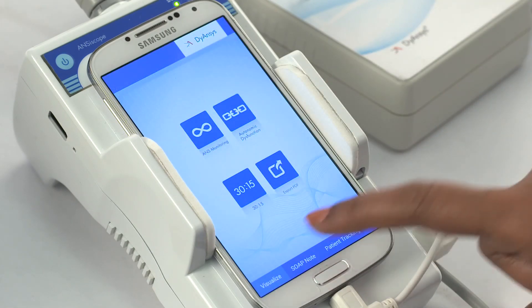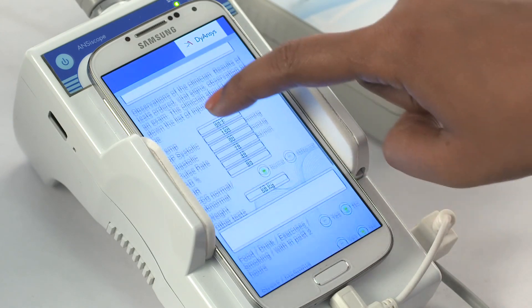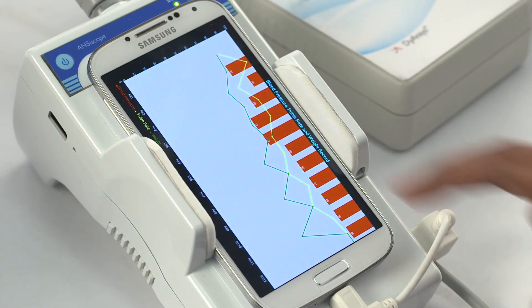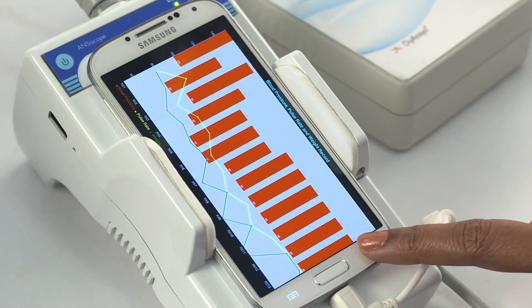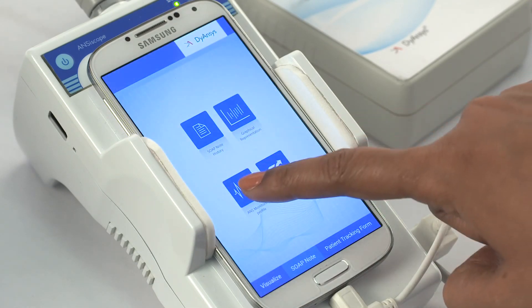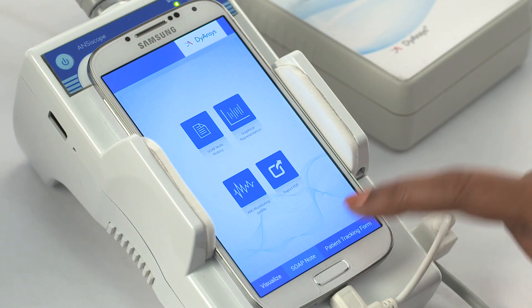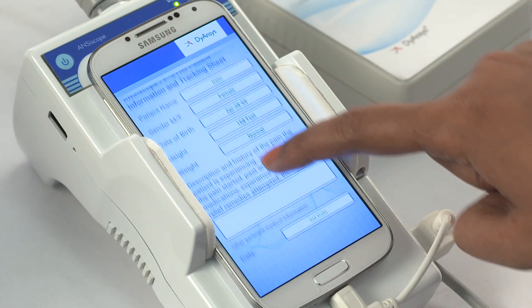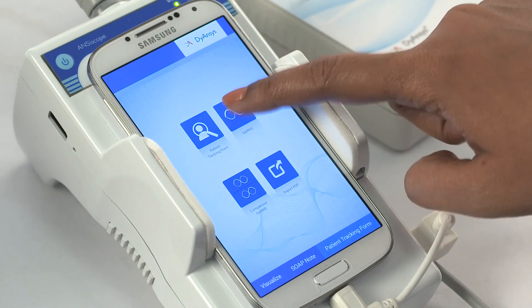Select the SOAP note. Press the SOAP note history to find all patient SOAP records. Then go back. Select the graphical representation to view the graph of all the treatment. Then go back. Select the ANS monitoring profile where the ANS graph is seen for all treatments. Go back to select the patient tracking form. Select patient tracking form history to view all patient tracking forms. Then go back. Select the balance.